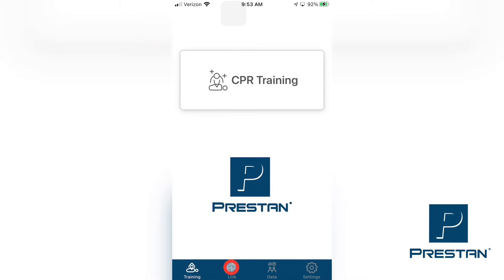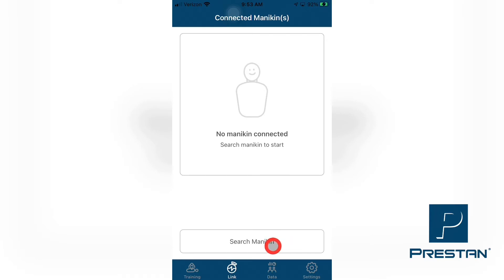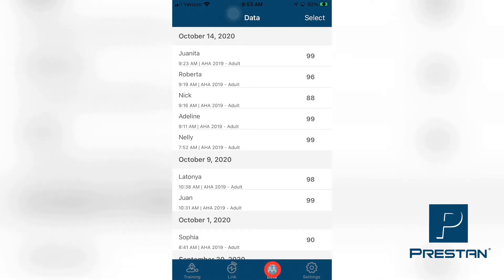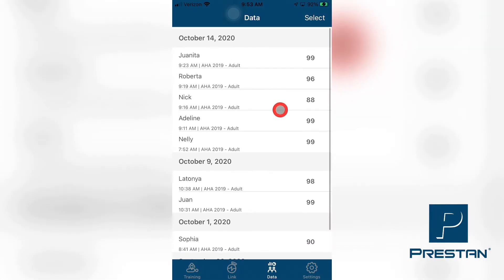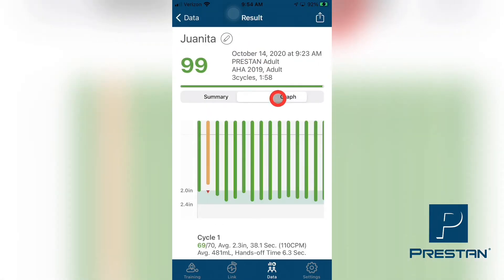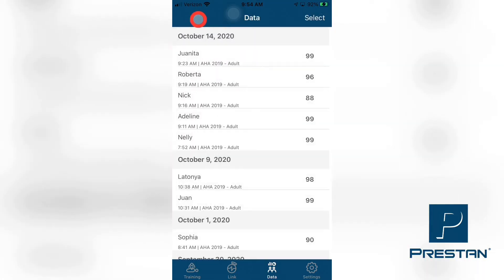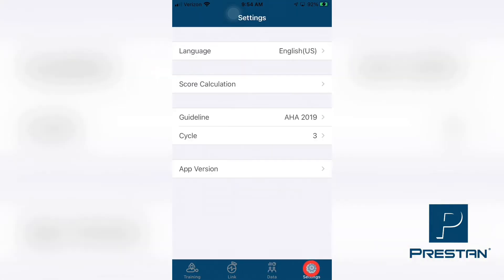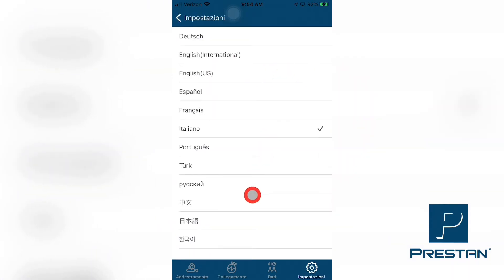The Link tab will allow the instructor to connect to and manage all of your mannequins. The Data tab allows for the access and review of any historical training data that has been completed and captured using your smart device. The Settings tab allows for the managing and changing of the settings on the Preston CPR Feedback App.